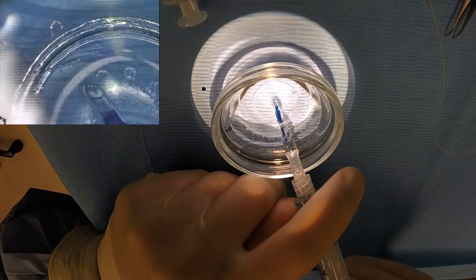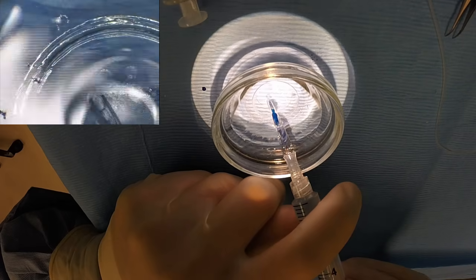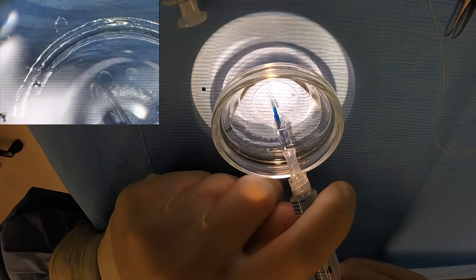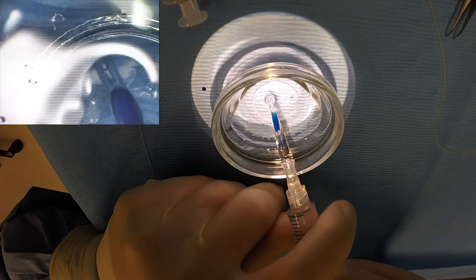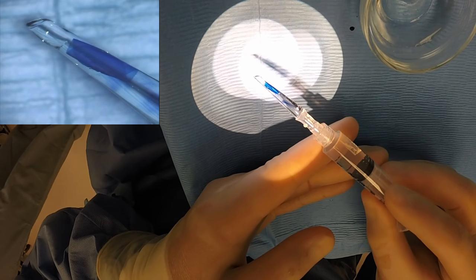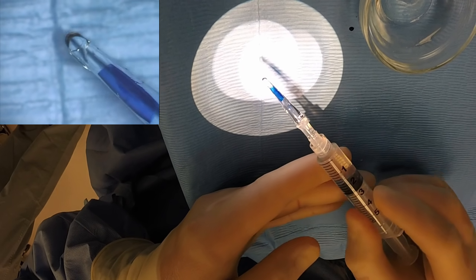Occasionally, in early cases, I've seen the graft pulled all the way into the syringe. If that happens, what I typically would do is pull the plunger all the way off and then dump the graft back into the glass dish to try again, rather than forcing it through the tip of the syringe.